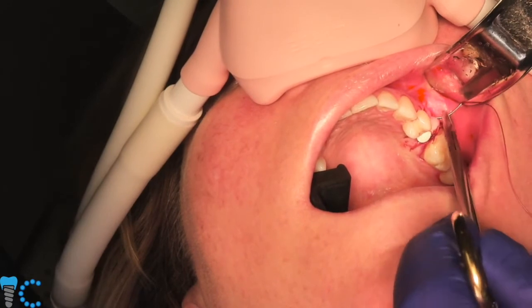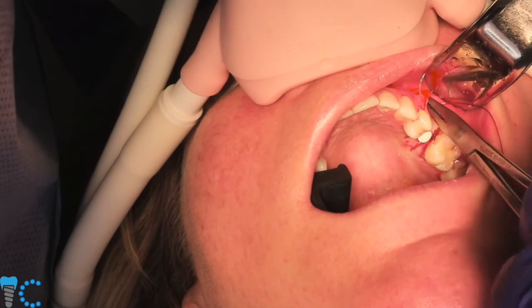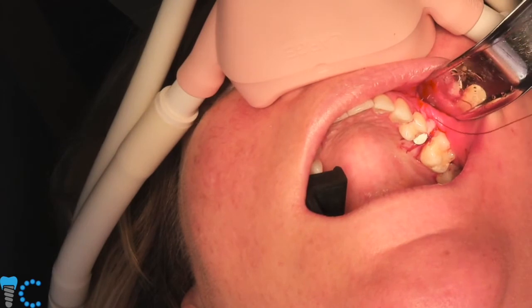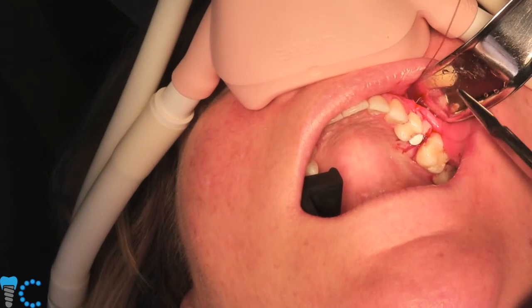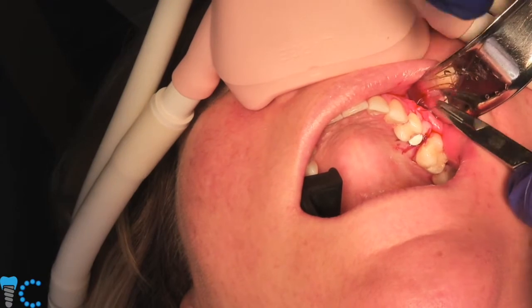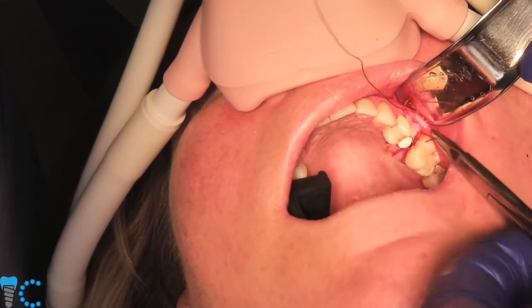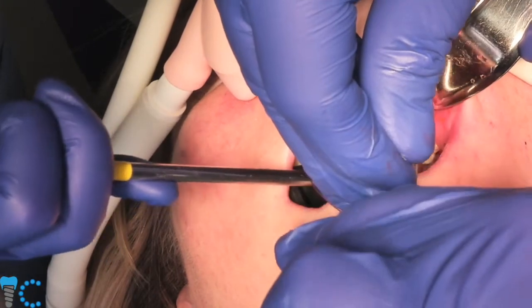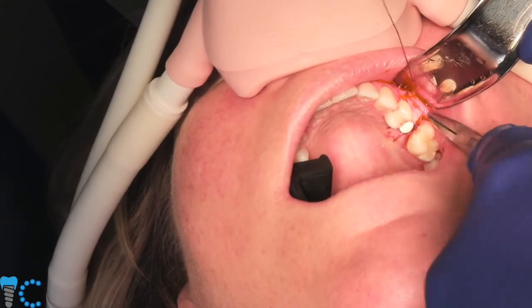If you didn't lose any of the tissue, you could still often see the collar and part of the implant through the tissue, and it's aesthetically very troubling, especially in the smile zone, obviously. So the beauty of this implant is before you prep it, you can't see any of the implant under the tissue. Even spectrophotometric analyses show that this implant's invisible through soft tissue. And then the ability to prep it means we can modify the top of it exactly like we would modify a tooth for a crown prep to get that ideal crown that we're looking for. And again, it's a restorative driven specialty.